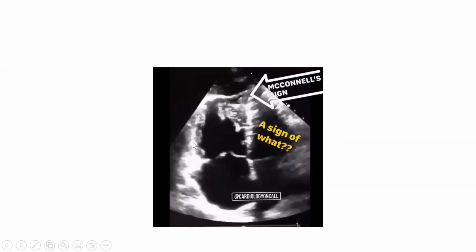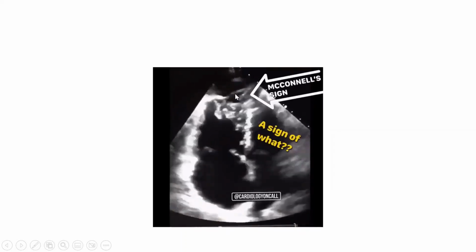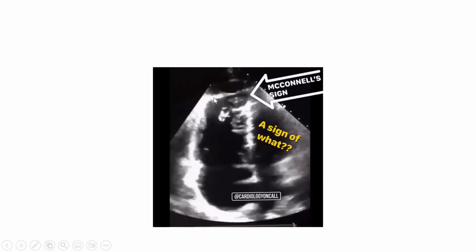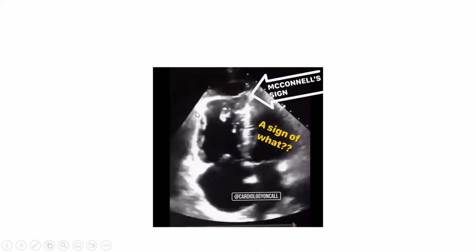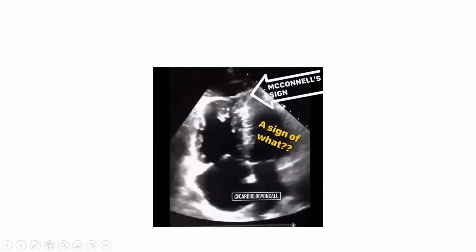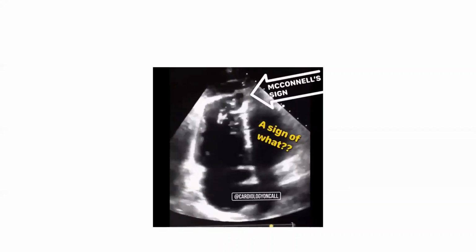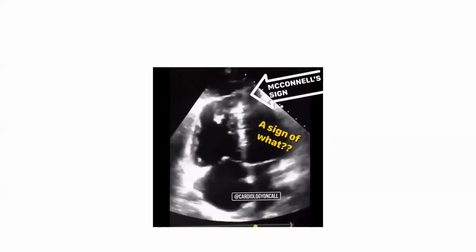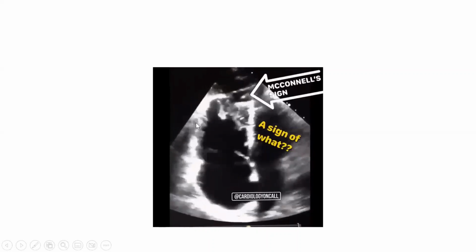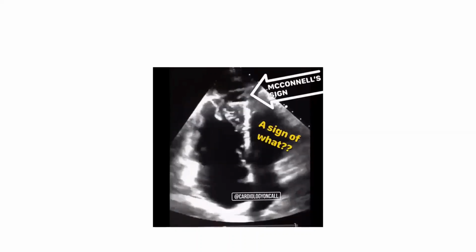Look at the contractility of the RV in the free wall and in the apex. It's McConnell sign, exactly. So what is McConnell sign? It is hypokinesia of the mid RV free wall with a hyperkinetic RV apex. To make it easier, say apical sparing hypokinesis. So there is RV hypokinesis sparing the apex. So the apex is normally contracting or hypercontracting, while the RV free wall is hypokinetic. Okay. A specific sign of pulmonary embolism.